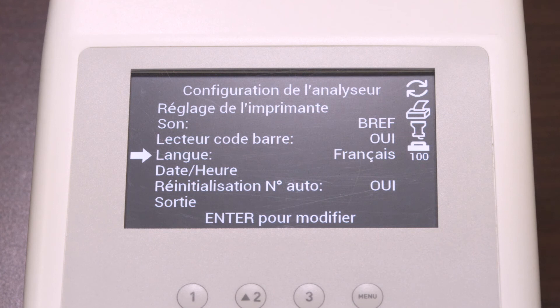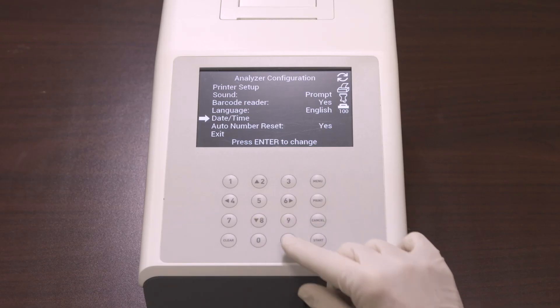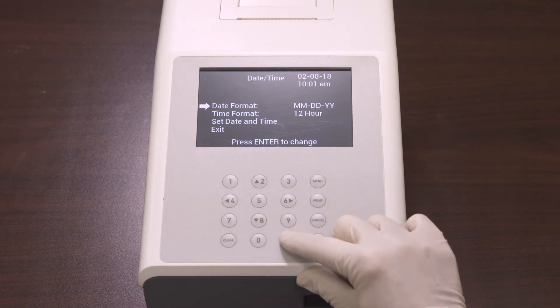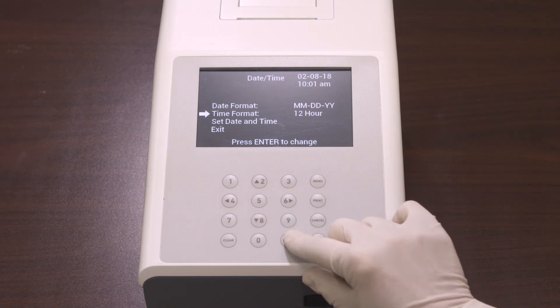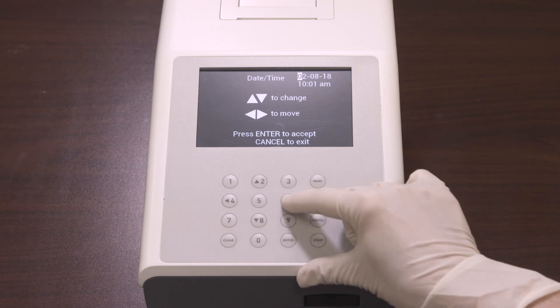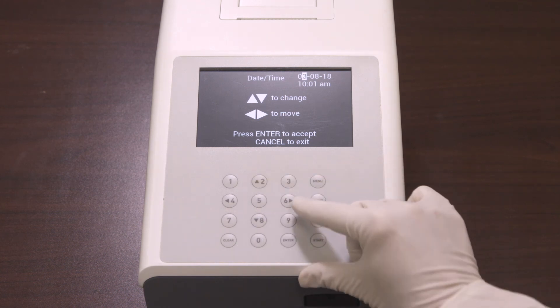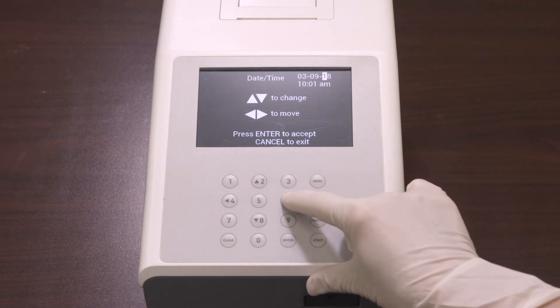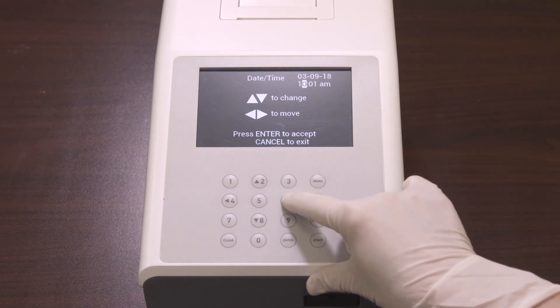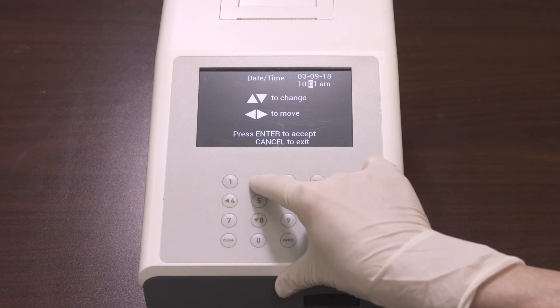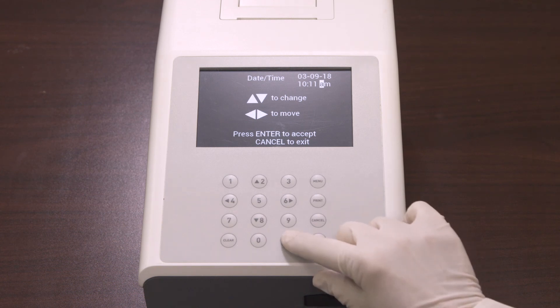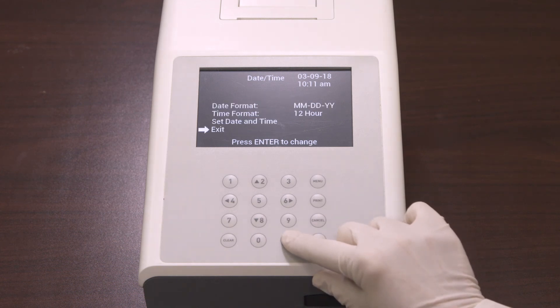The next selection is the language. Select the language and press enter to change the current language; each time enter is pressed the language changes. Then set the current date and time. Select date/time and press enter. This will allow you to set the date format, time format, and set date and time. Select set date and time and press enter. The first digit to be changed in the date will be highlighted. Press up or down arrows to change the number one at a time, then press left or right arrows to progress to the next digit. Press enter to save the changes or press cancel to discard changes. Either key will return you to the previous screen.